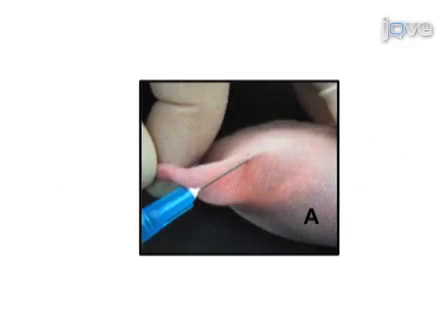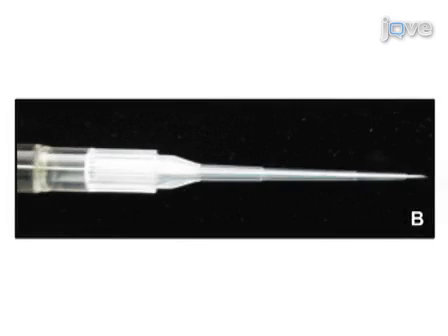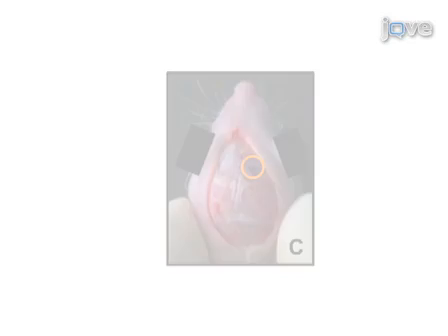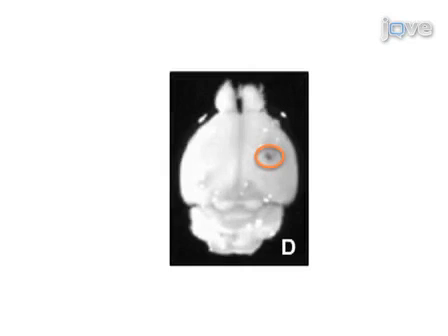For many years, transplantation models using human brain tumor cells have primarily involved subcutaneous injection in immunocompromised mice. Recently, there has been a shift towards injection into the appropriate anatomical structure, the brain. In this video article, intracranial tumors are established in mice using an injection method in which a hole is created in the skull and a needle is used to inject tumor cells modified for bioluminescence imaging.